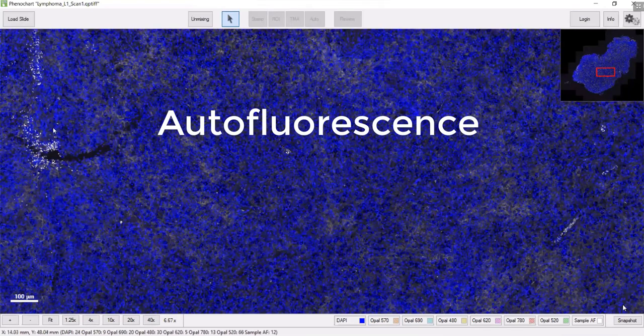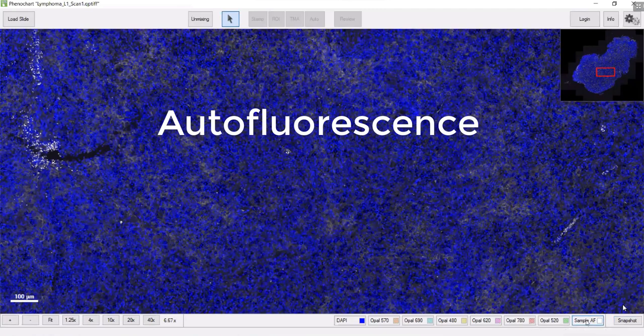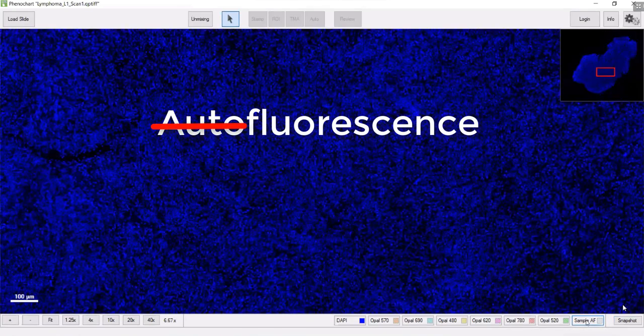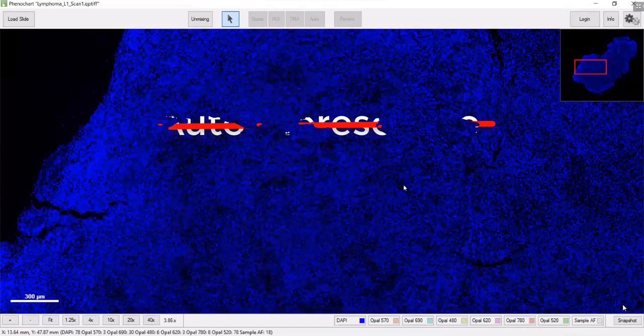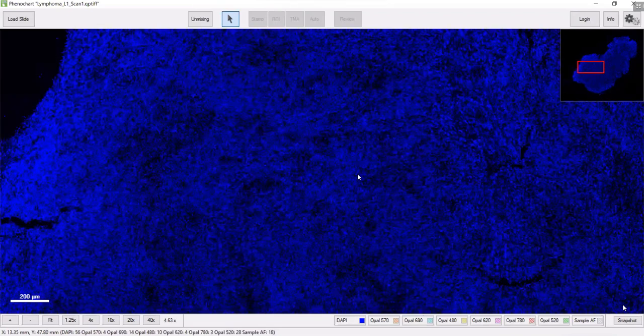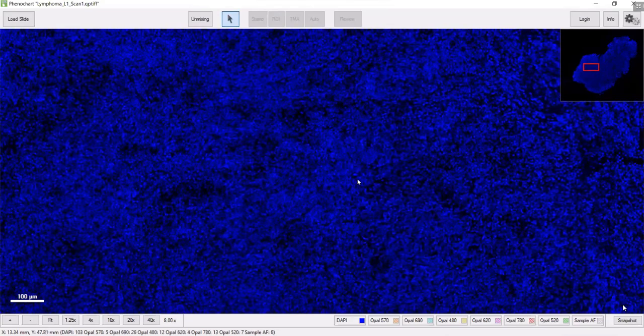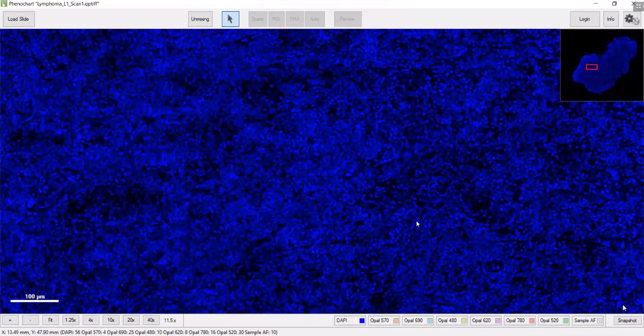You can see the red blood cells in this case being unmixed and removed from the sample. I'm going to start with just the DAPI on, and then I'll turn on layers so you can fully appreciate all the information contained in one of these samples.